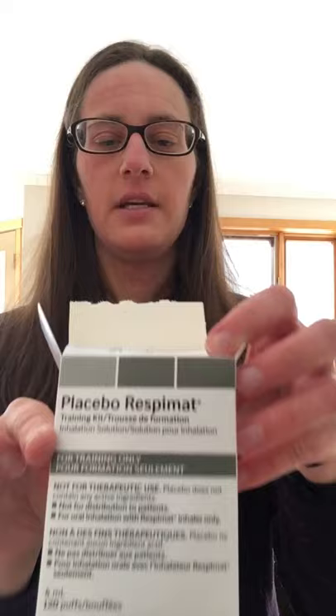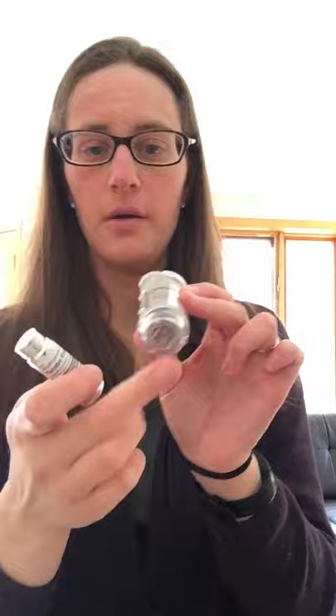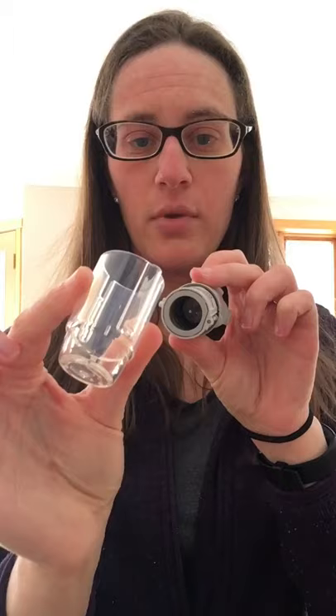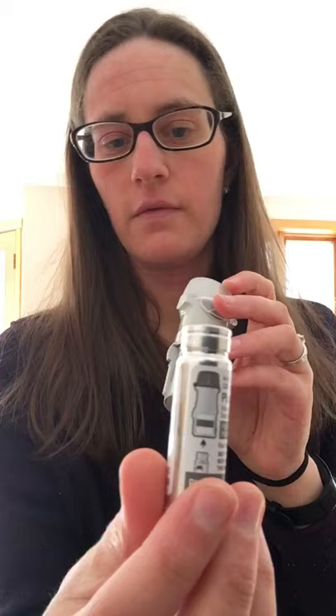So I have a placebo here. When it comes brand new from the pharmacy you will receive it in two pieces most of the time. Sometimes the pharmacies assemble it, but most of the time this is how it's going to come. So what you need to do is insert the little canister into the actual inhaler itself, into the bottom part. There's a little button on the side that needs to be pressed in, and then you pull the plastic cap off. The canister is inserted into the bottom — it only goes in one way, so if you try the opposite way it won't fit. It's also printed on the canister itself showing you which way to put it in.